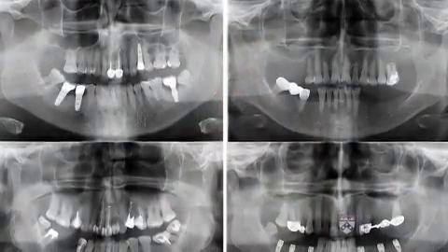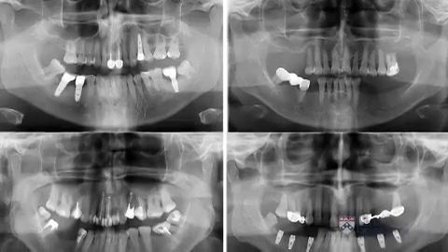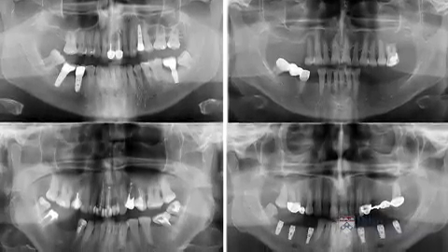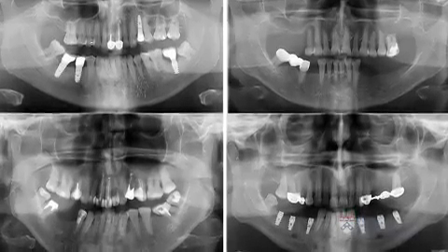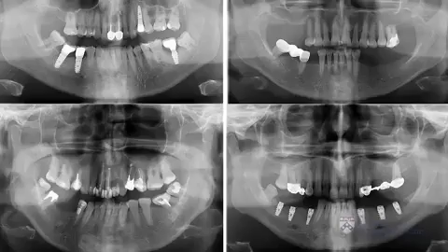The biointegration of the titanium tooth root with human bone is highly predictable, and the results are very long-lasting. The industry has also focused on reducing treatment time, and some implants can be placed immediately after the tooth extraction as opposed to waiting 6 months after extraction. In many instances, dental implants are now the standard of care if a tooth needs to be extracted or if there is a question as to whether a root canal procedure should be done.